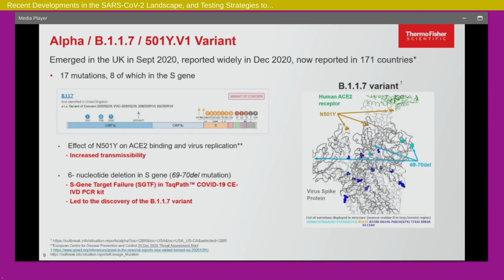We said, let's look at it. We looked at it, and the assay was fine. Next thing you know, they did the sequencing, and they found that there was a deletion in a region that we were targeting, and that had led to that one target having decreased sensitivity. But the other 2 targets were fine. So you were calling them positives, but they had an interesting pattern. That's how they identified the UK variant. I'll talk a little bit about what we call the S gene dropout in my next slide.